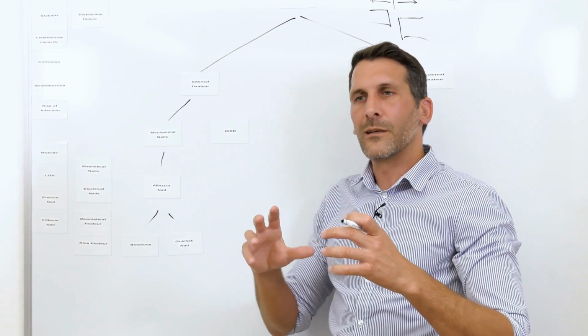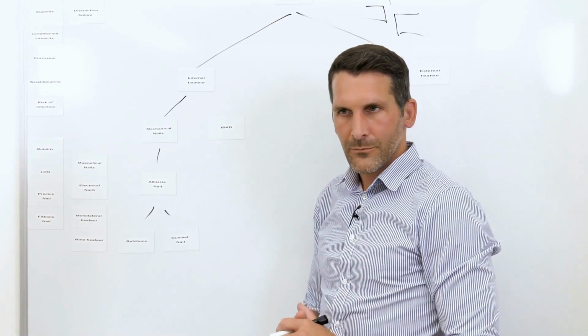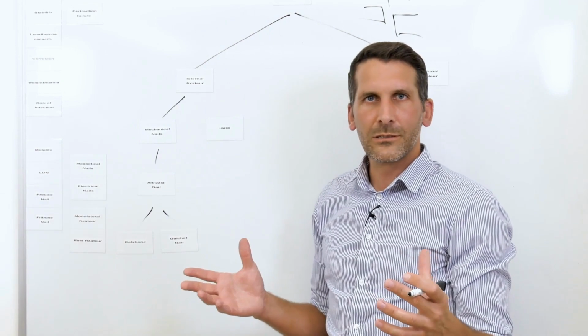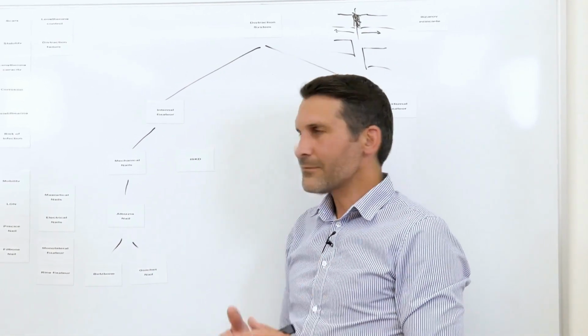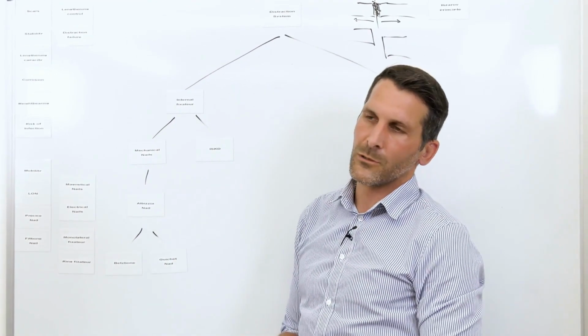Very simple, because the control over the feed mechanism was correspondingly poor. That means either it extended at an uncontrollable speed, or it didn't extend at all, because those ends were already ossified. That means the control of the feed was very poor with this one. And for that reason, it has practically been taken off the market.